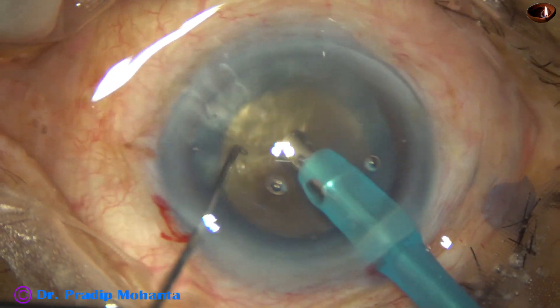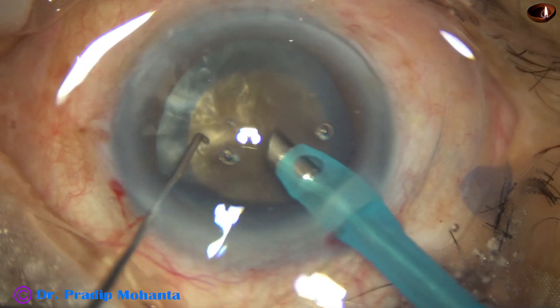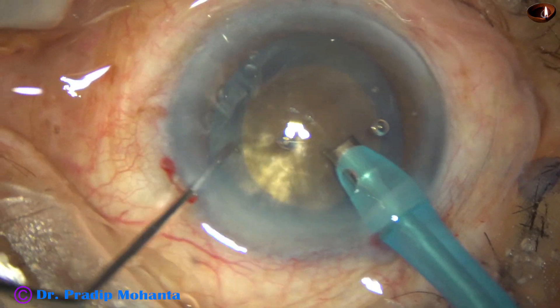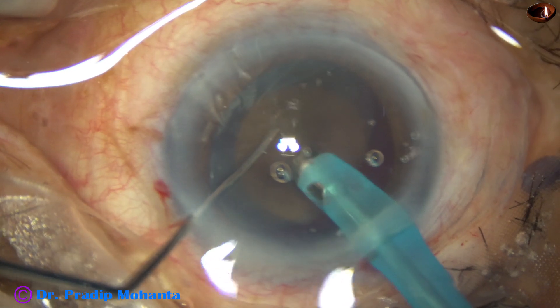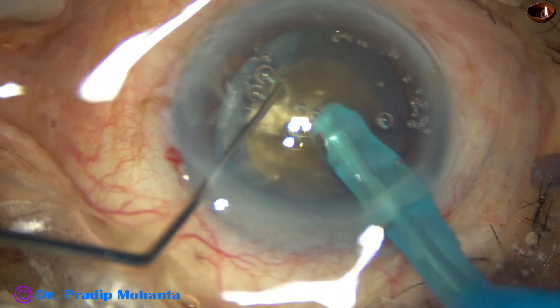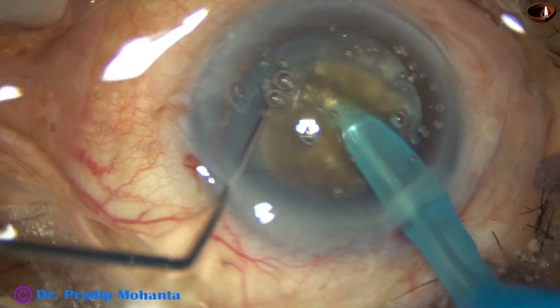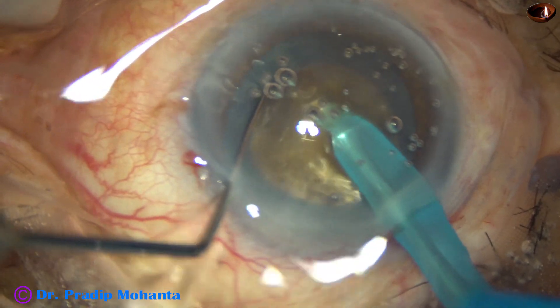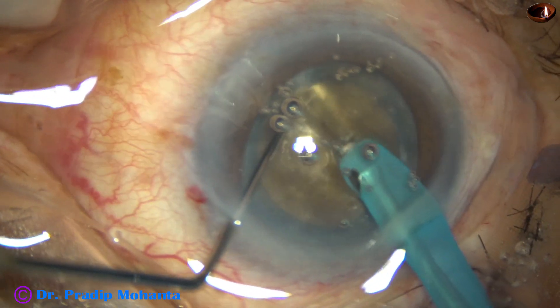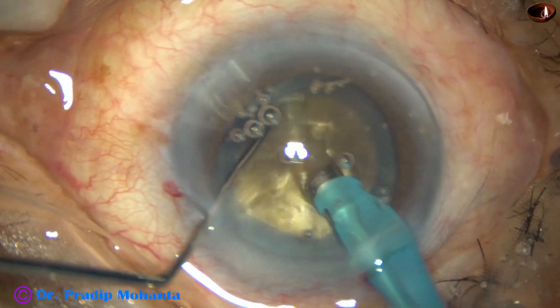I go in, turn the bubble up towards the cornea, and try my submarine job. I go through the substance of the nucleus from one side of the equator to the opposite side. But in this case we could not separate the leathery fibers, so this is just a trench.